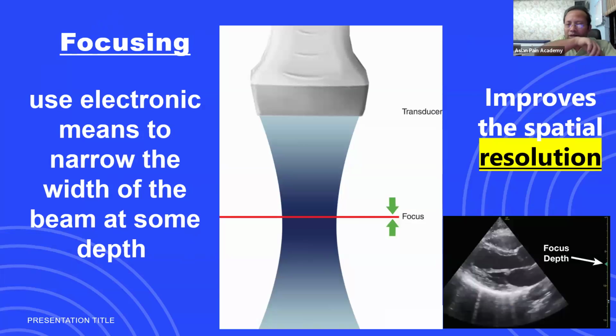So here also, some machines have focus. My machine also has focus. If I want, at some depth, wherever my structure of interest is, there I will place the focus. This is the focus probe, I mean the focus point.